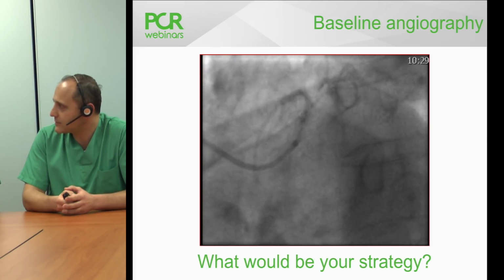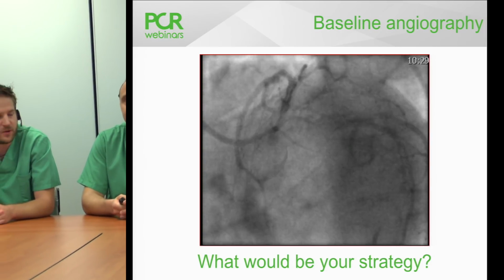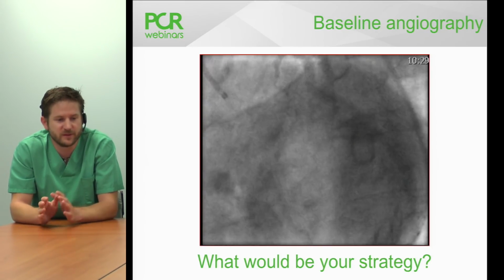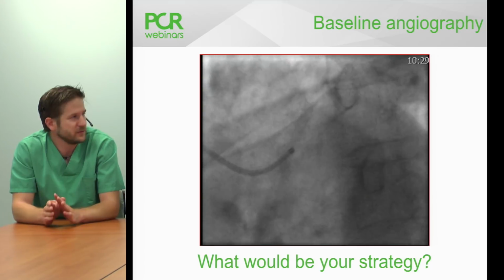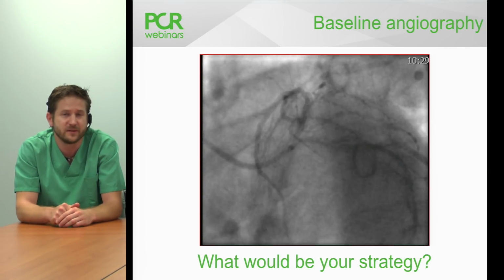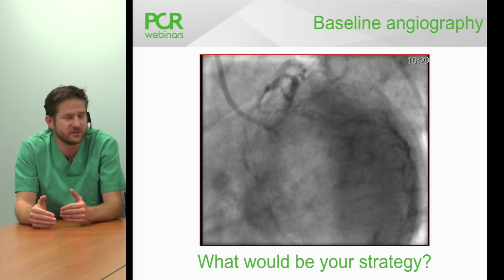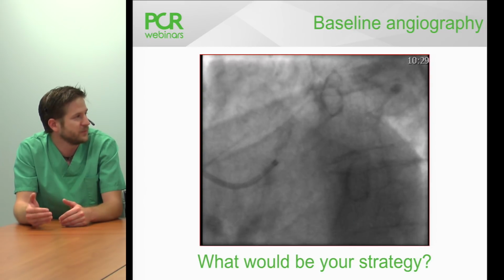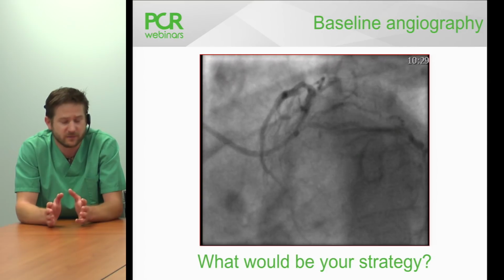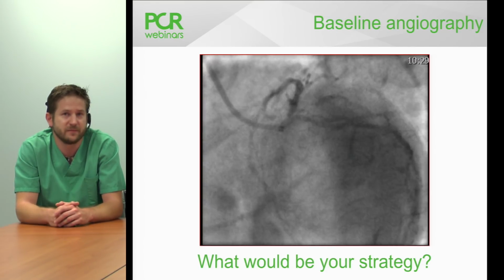Any opinion about that? We have good data that invasive imaging correlates very well with functional importance in the left main. Most probably this is the location where we have a really nice correlation between the invasive imaging and the functional importance. In addition, imaging can later on during the procedure even help to optimize and guide the PCI. So I'm convinced that imaging is a valid tool for assessing this left main.